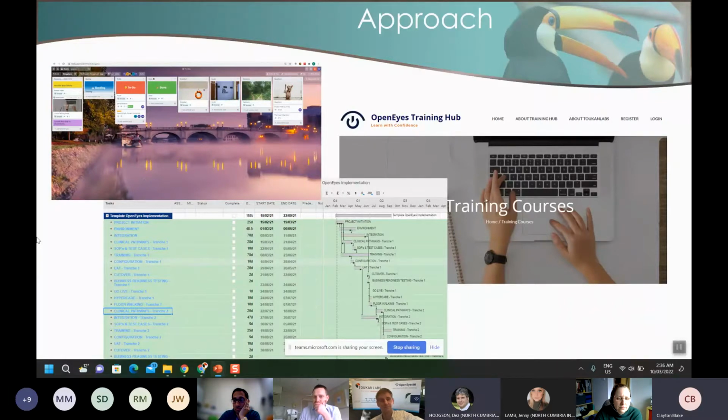So single sign-on. Is that essentially just using an LDAP lookup? The system will link to our domain controllers, right? Are you aware that we've actually got two Active Directory domains at the moment with users migrating between the two? So we've got the same user on both domains. Can it cope with that? Some systems can, some systems can't. Actually, you saw Ian talk about the Wales rollout.